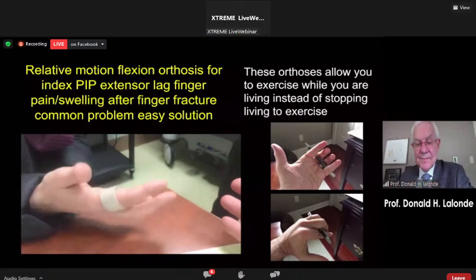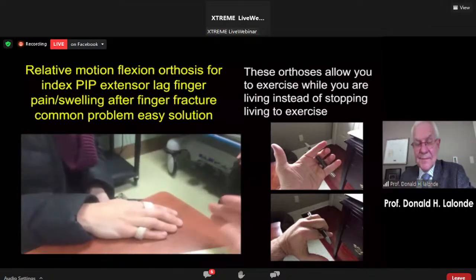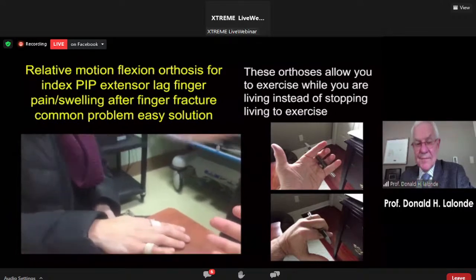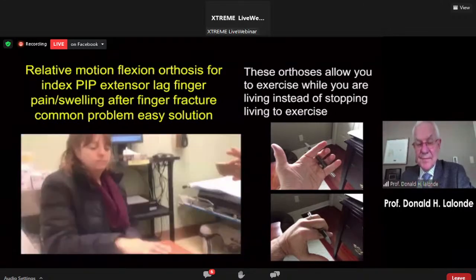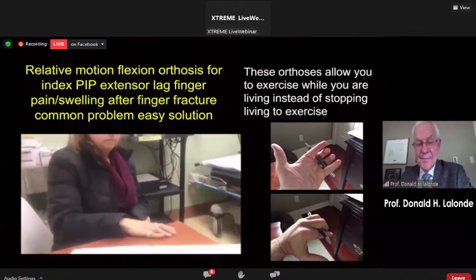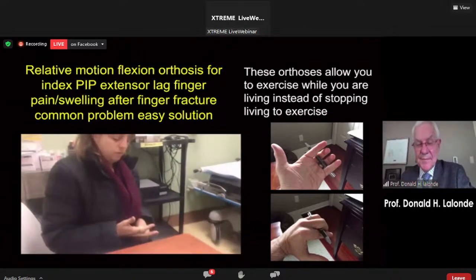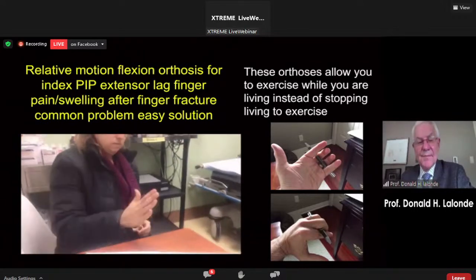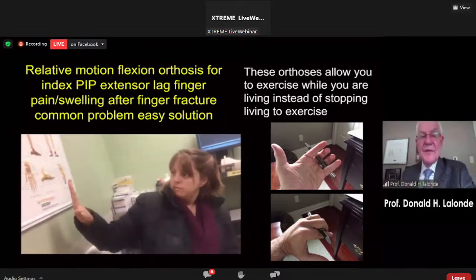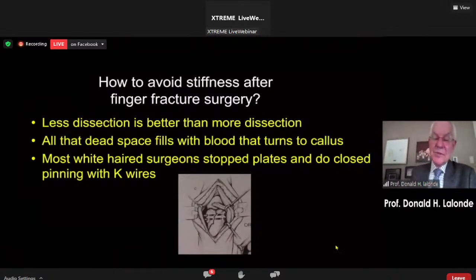And the other thing you just told me is that within 2 hours of putting the splint on, your finger felt better. The swelling was better. I couldn't believe it. Yeah, just 2 hours and the swelling got all better. Right. So take your splint off now, please. And just show me your full extension. So you got all your extension back. So for extensor lag after finger fractures, work with your hand therapists and get them to do relative motion flexion splinting.